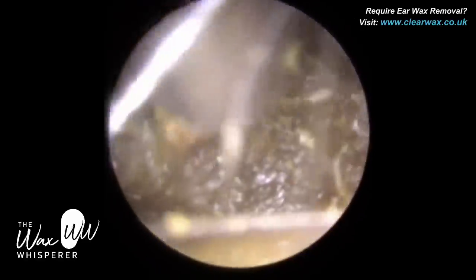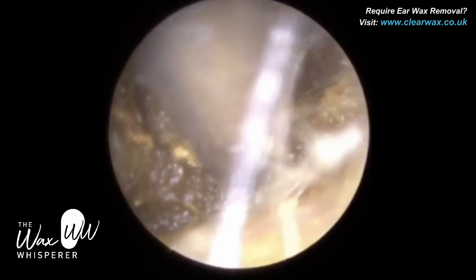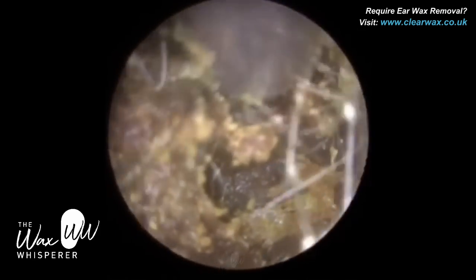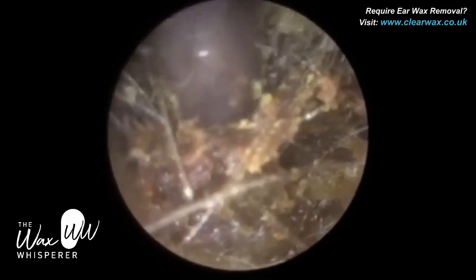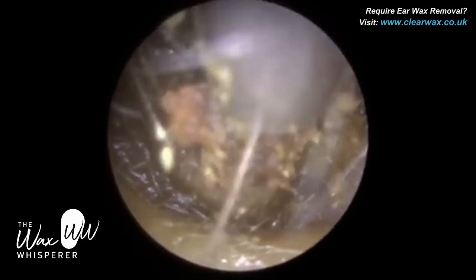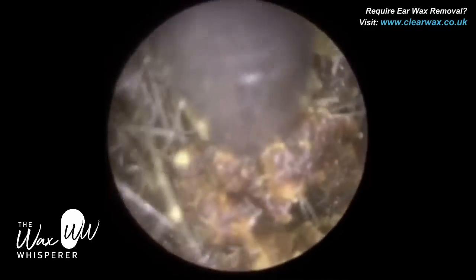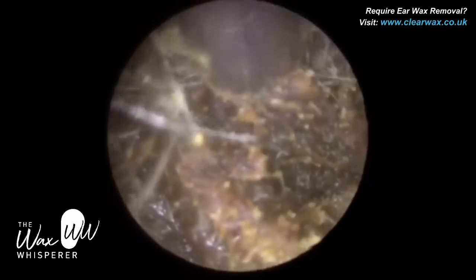The wax is quite stodgy and glutinous. What I'm trying to do is elevate it, lift it off the posterior inferior canal wall — posterior means the back part of the ear canal, inferior means the bottom. This is where the first bend of the ear canal is. There are two bends: the first is about half a centimeter into the ear canal and the second is around a centimeter in. You quite often find that if you start off by just loosening the plug of wax from the posterior inferior canal wall, it makes removing the rest of the plug a lot easier.